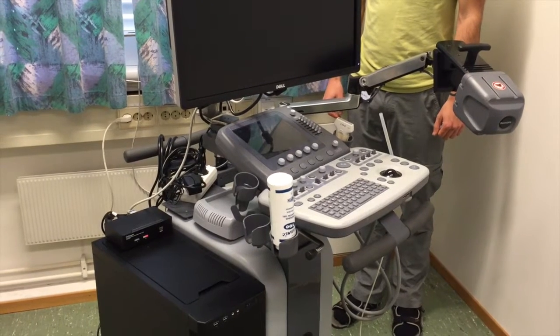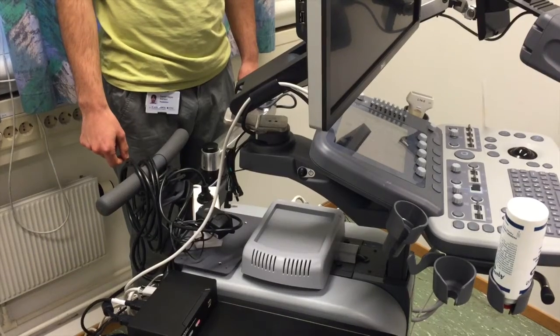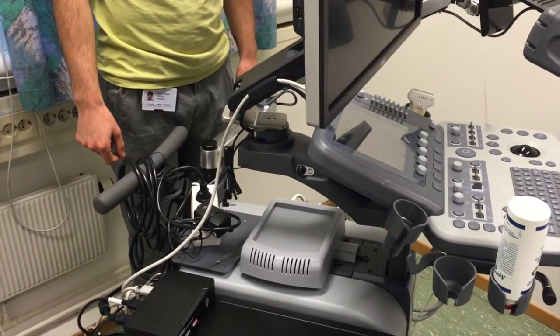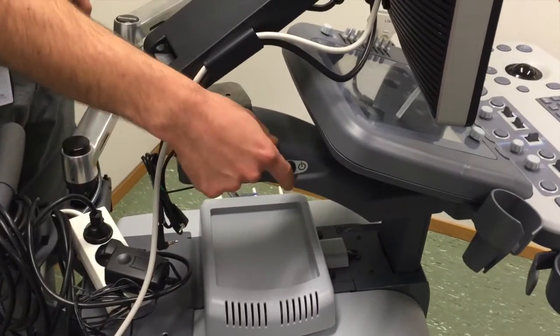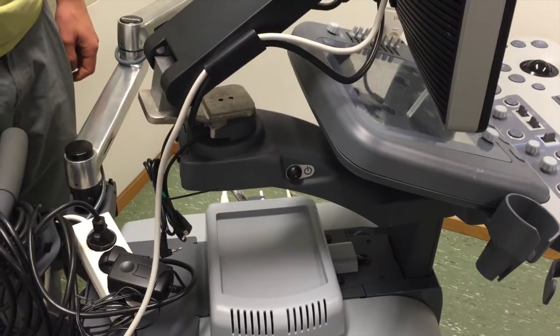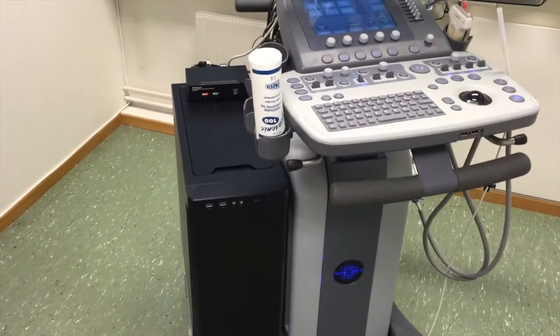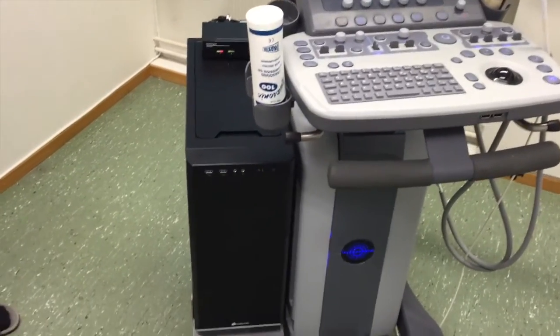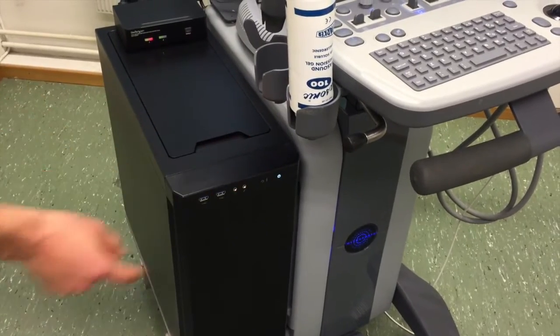We will now show how to start the system. The first thing we have to do is to boot up the ultrasound scanner by hitting this button. While waiting for the scanner to start up, we also boot the assistant computer by hitting this button.